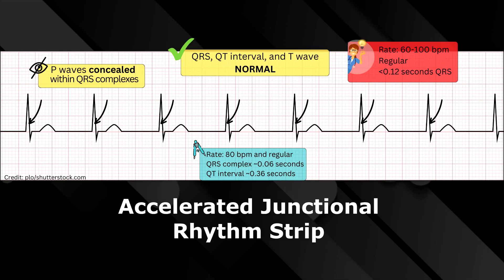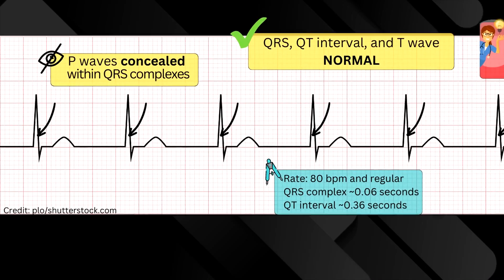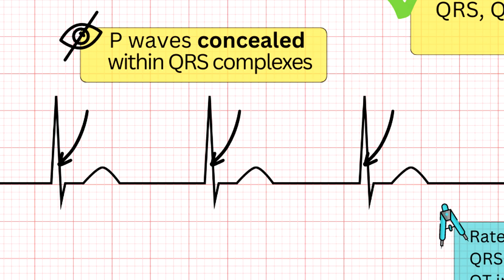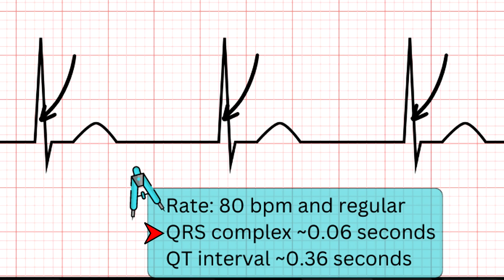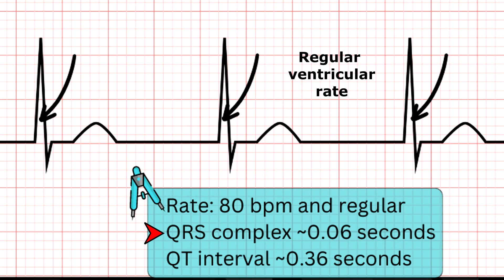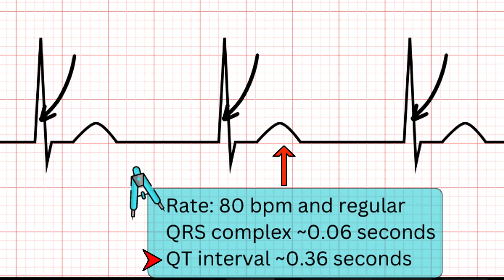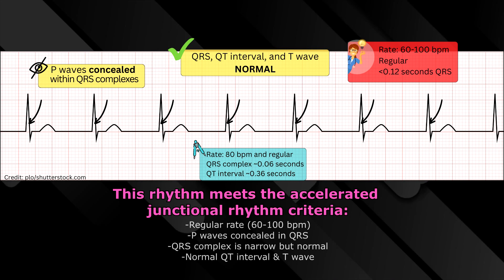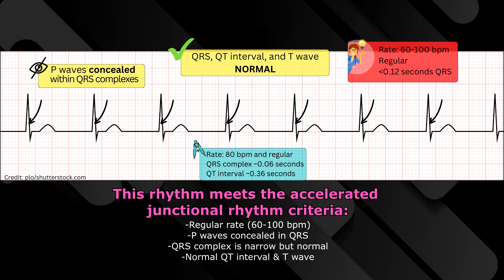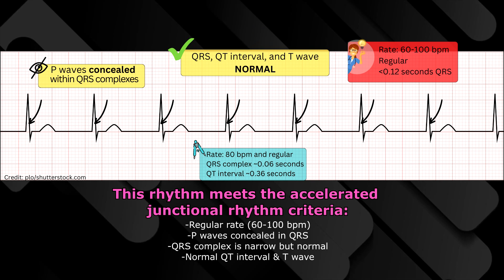Now let's look at this rhythm strip of accelerated junctional. We can see immediately that there are no visible P waves — our P waves are concealed within our QRS complex. The QRS complex is narrow, measuring about 0.06 seconds. Measuring from R wave to R wave, we notice it occurs regularly, so we have a regular ventricular rate. The QT interval is normal, measuring around 0.36 seconds, and our T wave is normal. When we count the rate, we get 80 beats per minute. This meets the criteria for accelerated junctional: regular rate between 60 to 100 beats per minute, P waves concealed within the QRS complexes, narrow QRS, normal QT interval, and normal T wave.